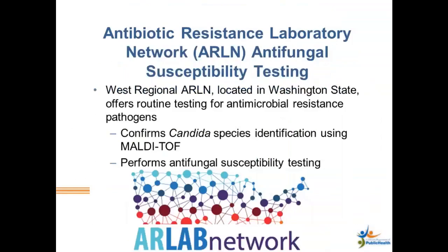Now, when it comes to antifungal susceptibility testing, I thought this would be a good place to mention the Antibiotic Resistance Laboratory Network, or ARLN, run by CDC. Our particular branch is the West Regional ARLN, located in Washington State. They offer routine testing for antimicrobial resistance in pathogens. One example would be confirming Candida species identification using MALDI-TOF, and also performing extensive antifungal susceptibility testing and providing those results to the submitting lab.